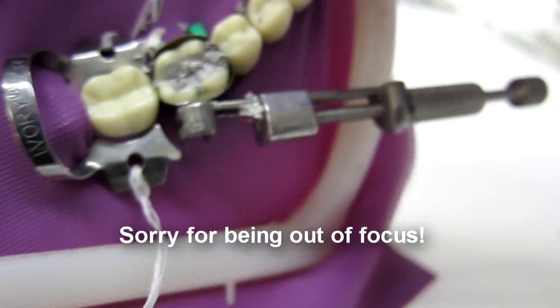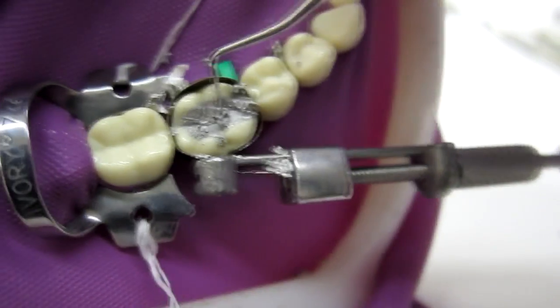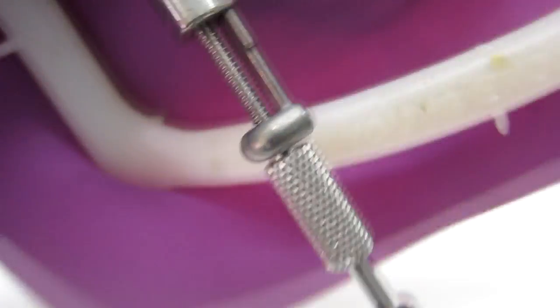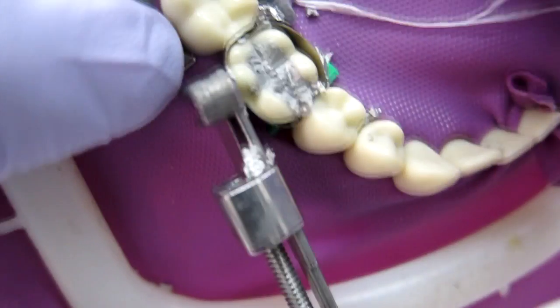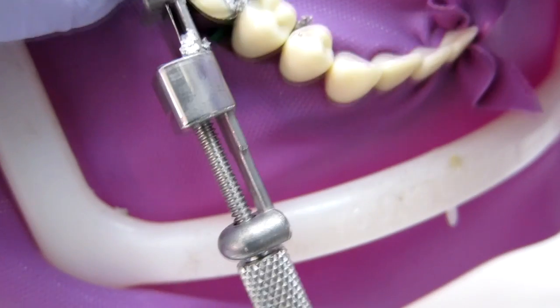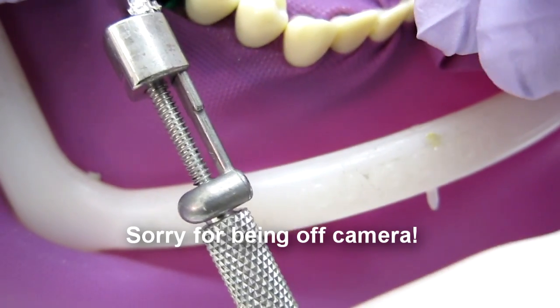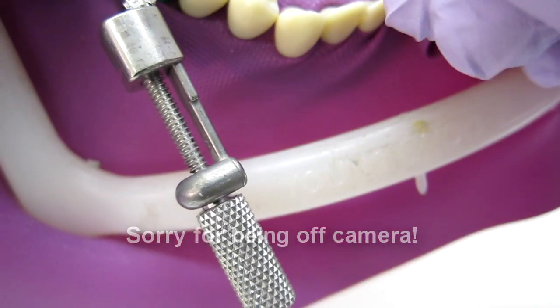Come across the other side — remember lingual cusps have more of a contour to them, so go up and down with that tooth structure. Because we condensed so hard, when I'm carving things come out nice and smooth — no pits, no pores. I'm always keeping the points of the instrument where I want the central groove so I get a nice defined central groove.